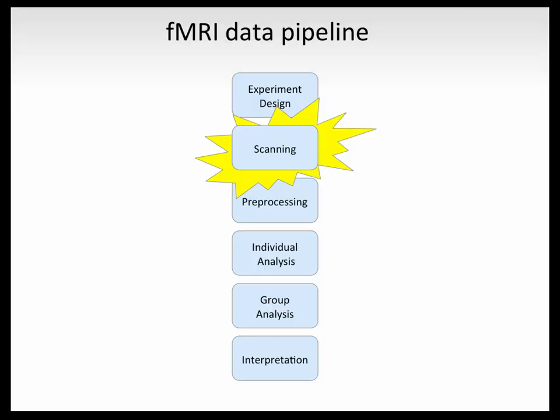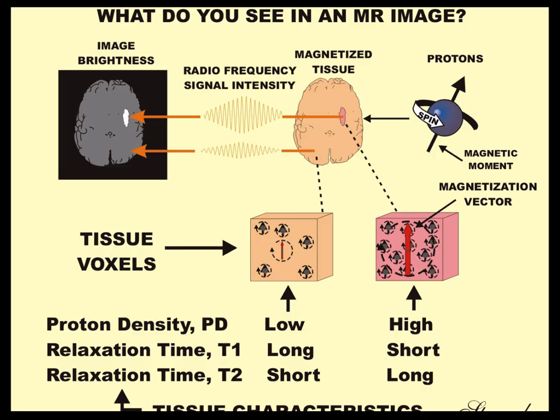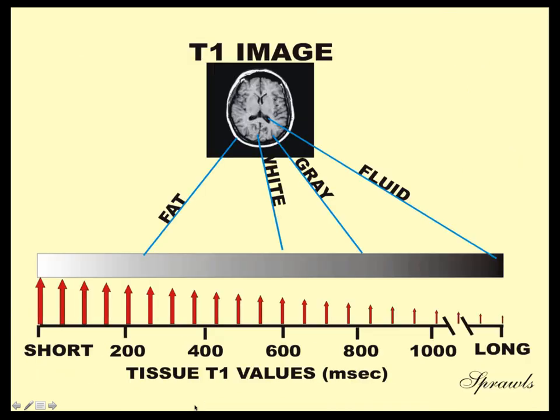So in order to do that, as I said, this is coming before the basic talk, so I'm going to give you a couple of quick slides about some of the vocabulary of what's going to come up later. Really what I want you to take from it is that in the MR image, the contrast that we're seeing is coming from two things: T1 relaxation time and T2 relaxation time, or T1 and T2 contrast. We can play around with the T1 and T2 contrast, which are properties of tissues, in order to change the grayscale that you see in the image.